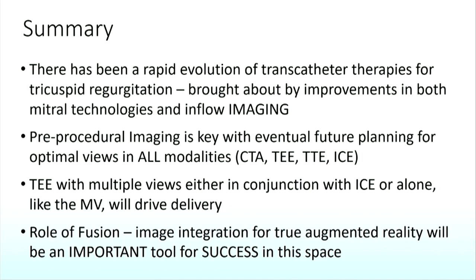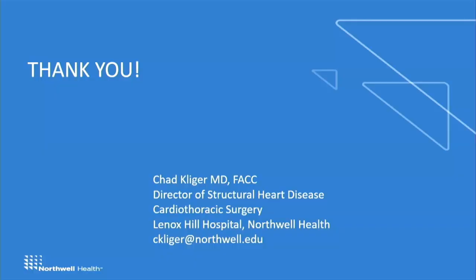TEE with multiple views in conjunction with ICE, or even TEE alone, will help drive delivery, and I think the role of fusion imaging, where we have image integration for true augmented reality, will really be an important tool for the success of therapy in this space. Thank you very much.